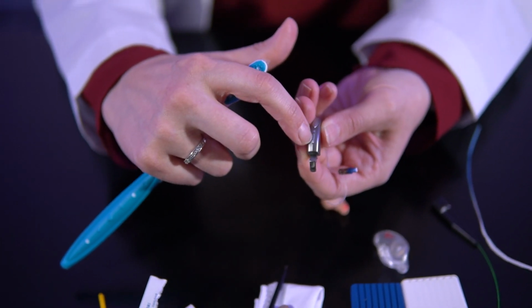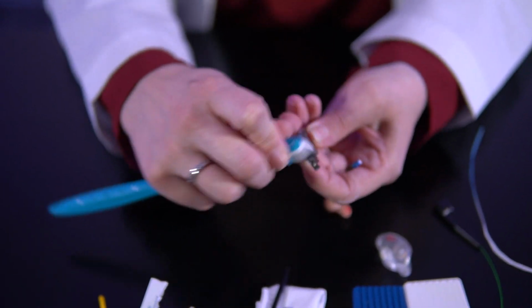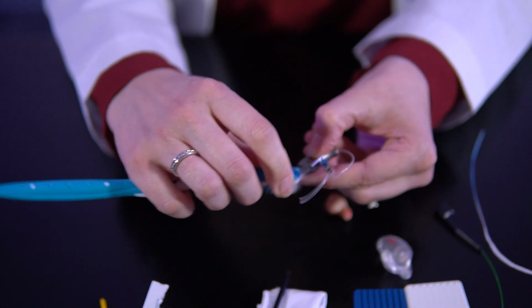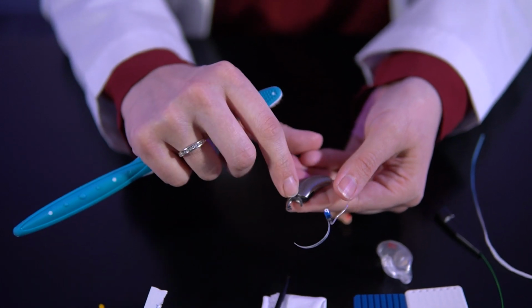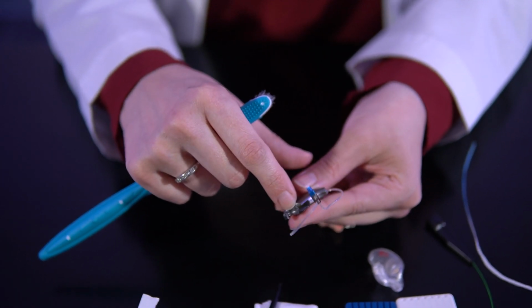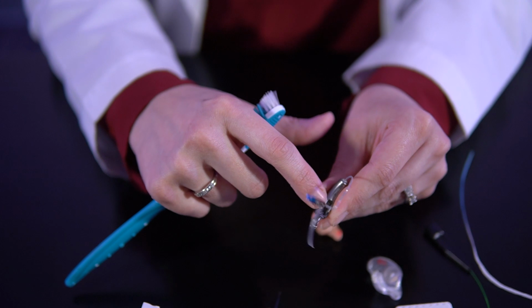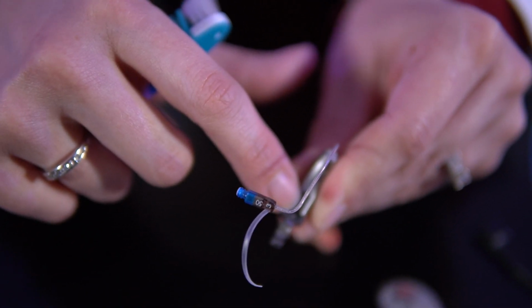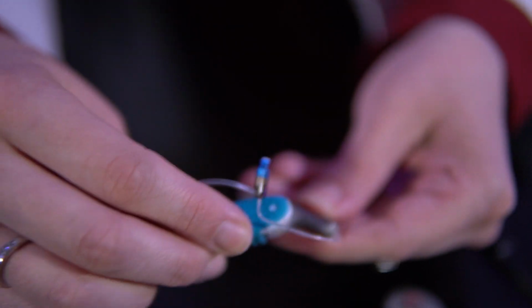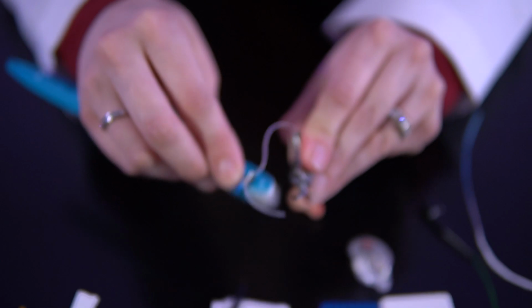Your push buttons, those will get gunk around them too. Clean that. Clean inside your battery door, because that can get corrosion in it sometimes, and dirt and debris. And you can even get inside this part right here. It's perfectly fine. You're not gonna hurt the hearing aid, okay? So we just wanna get anything that could be in it. We're just gonna brush it off, okay?